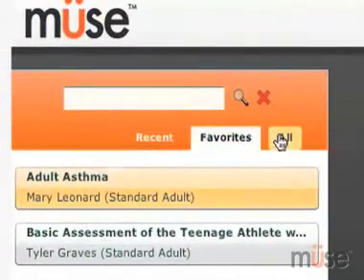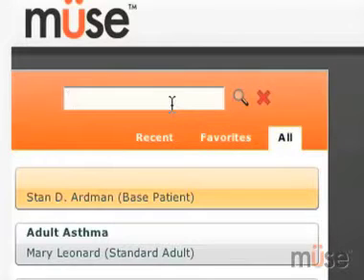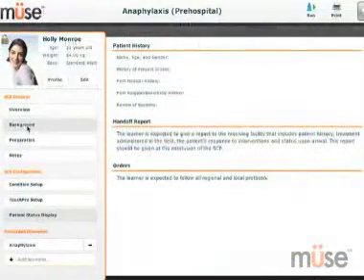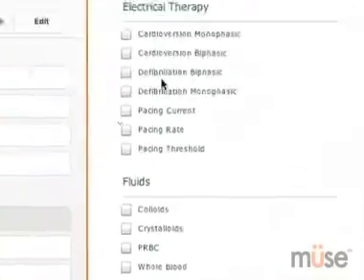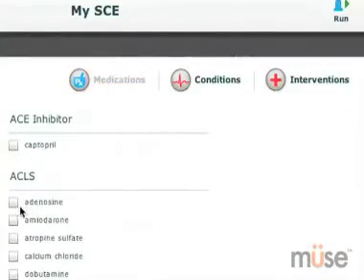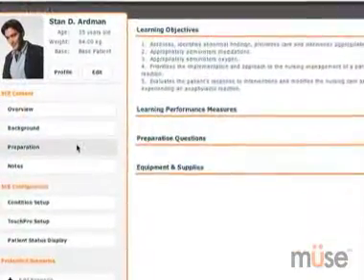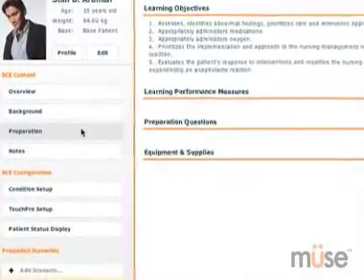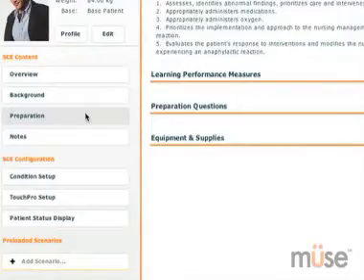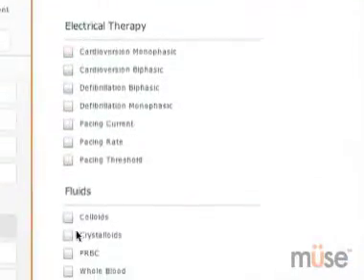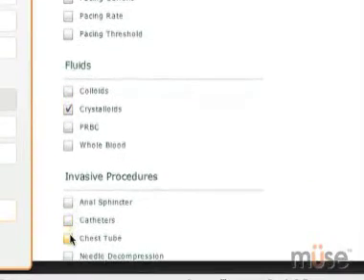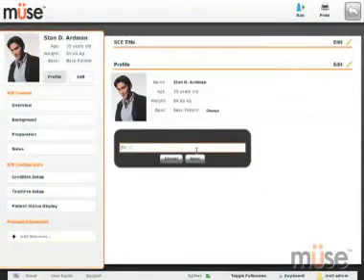MUSE allows you to organize your SCEs in the way that works best for you. You can easily access your recent or favorite SCEs, or search the entire library and all of the educational content associated with each SCE. What is unique about MUSE is how it allows you to easily set up your simulation so you are ready to teach. From the home page you can access any SCE or create your own SCE. Select a patient and associated relevant conditions, medications, and interventions. And once it's done, save it and reuse at any time.